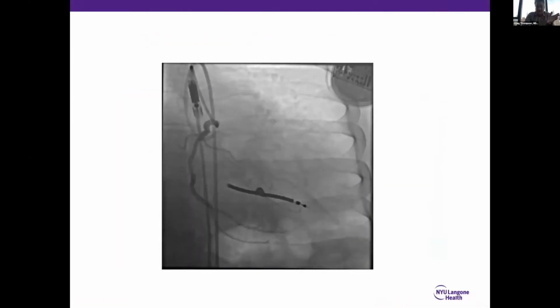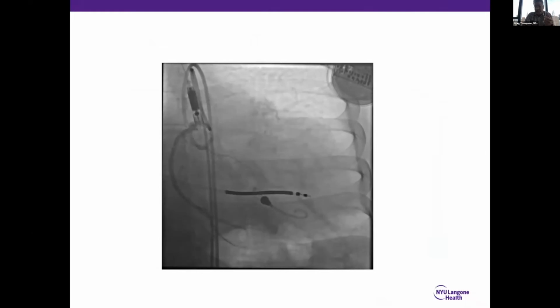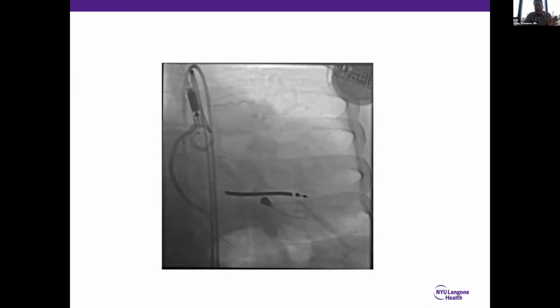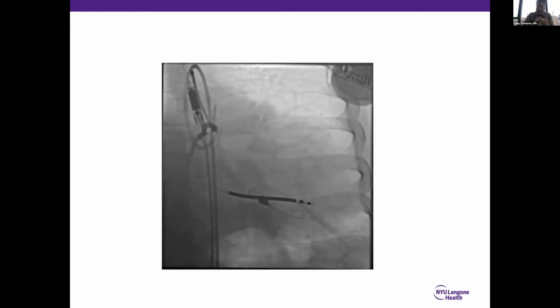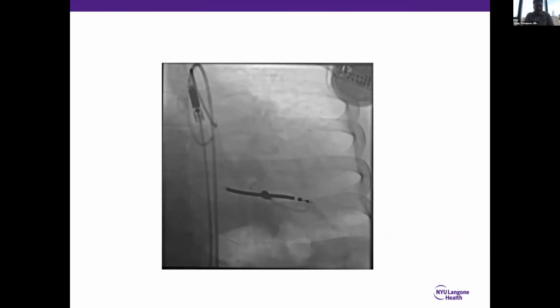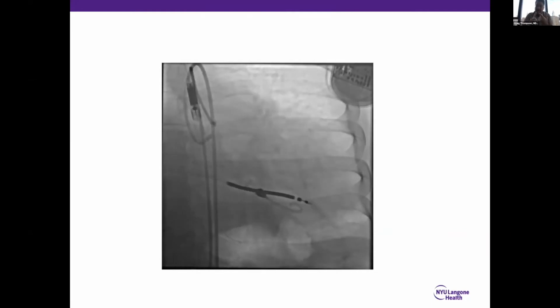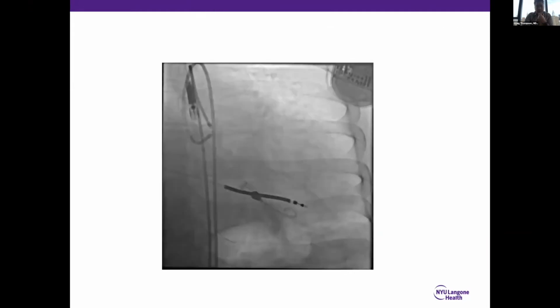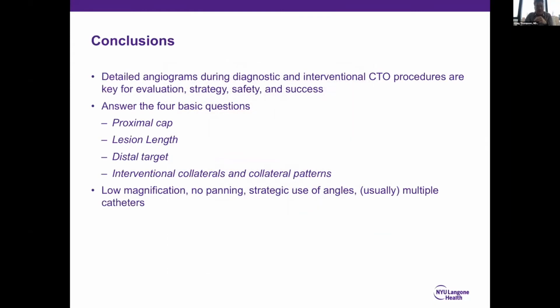So this, for instance, is simply a left main trifurcation. This looks like it's intact when you have two catheters in. It turns out it's a bridging collateral, and this is 3 separate CTOs that we did under protection not that long ago. But the dual injection and understanding every landing zone, every opportunity for retrograde, where our antegrade opportunities are, and how to avoid these bridging collaterals, because we went in both directions. I think two of the 3 vessels we did antegrade, one was retrograde or something to that effect, but it informed safely the sequence of how we did it, and the technical approaches and the follow-up approaches when some of those go into failure mode. And that's just a final angiogram, and the details of the procedure are otherwise immaterial.